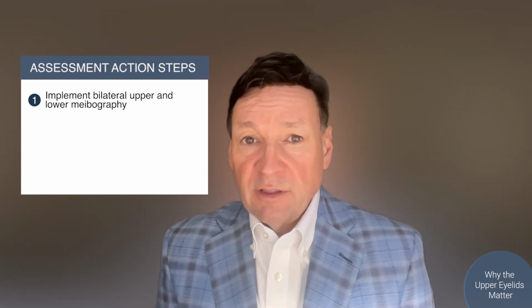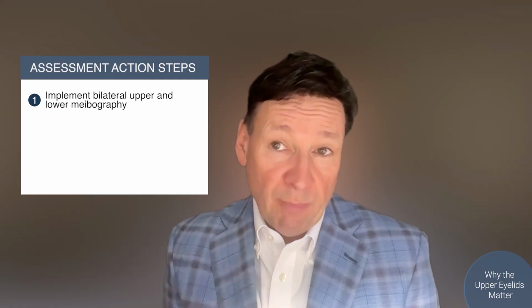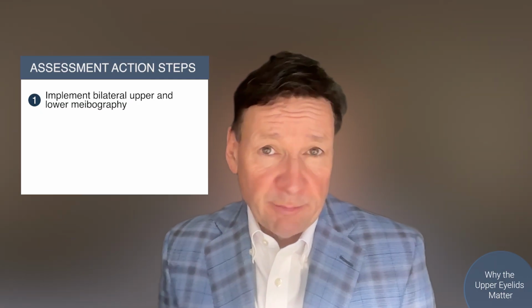We've talked about the evidence, the clinical impact, and the practice workflow. Let me leave you with 3 specific action steps. First, for your own practice. Start next week by committing to performing bilateral upper and lower eyelid meibography on your next group of meibomian gland dysfunction or dry eye patients.